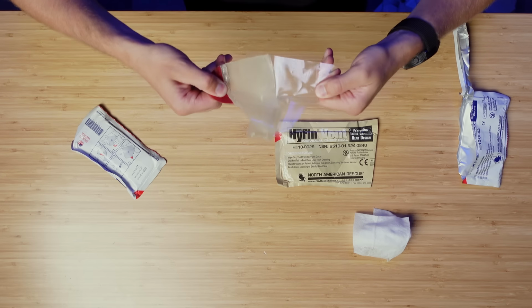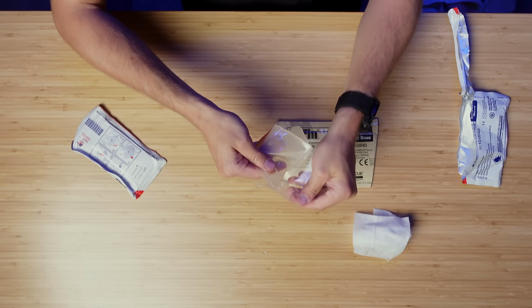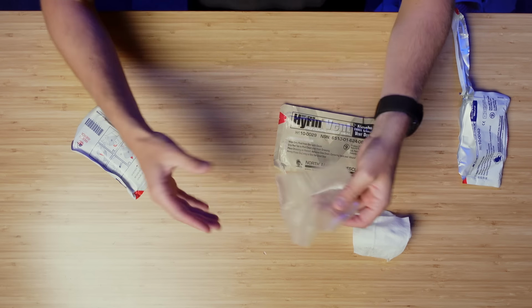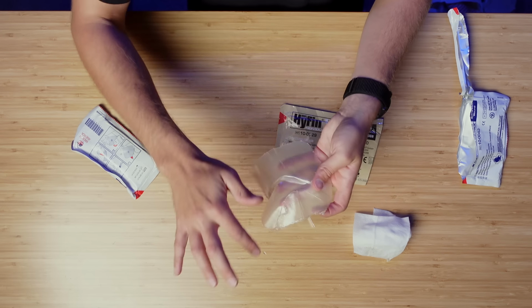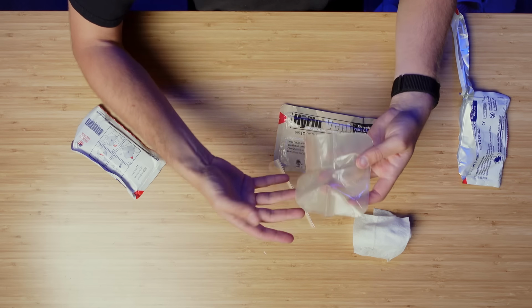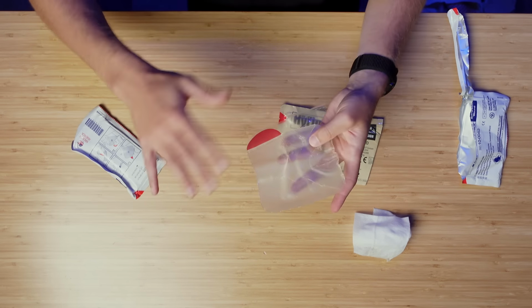Now here, we pull it off. Now you'll notice that the edges of this have gotten really gross. This still works just fine. This is a fine chest seal, but it is absolutely nasty. Now this one is vented. You can see these three portions that don't have the stickiness on it. I like vented seals, but now my hand's all gross. So be aware, chest seals are always gross, and these guys are small. It's a very small surface area.